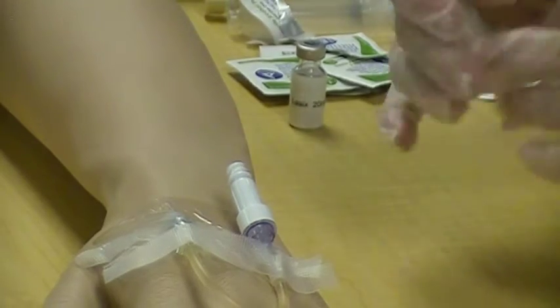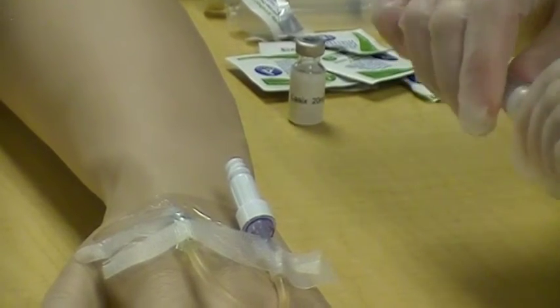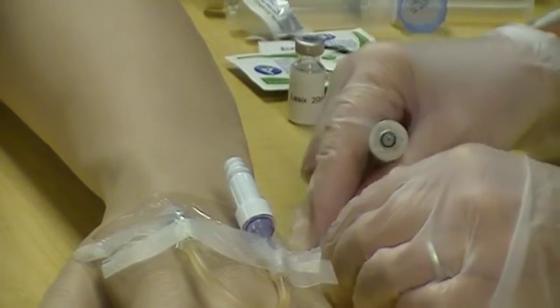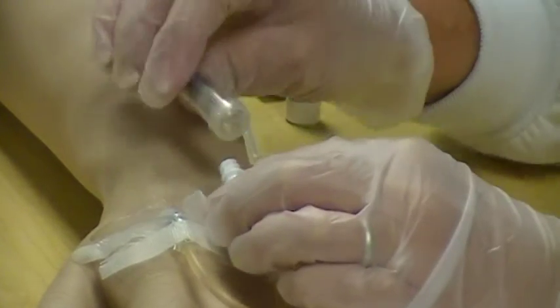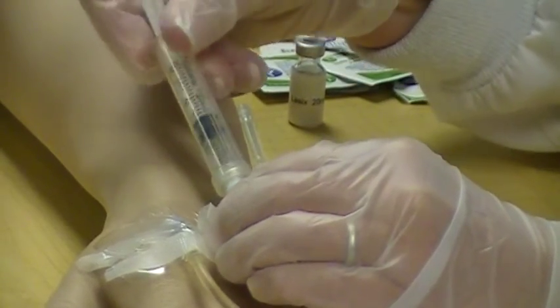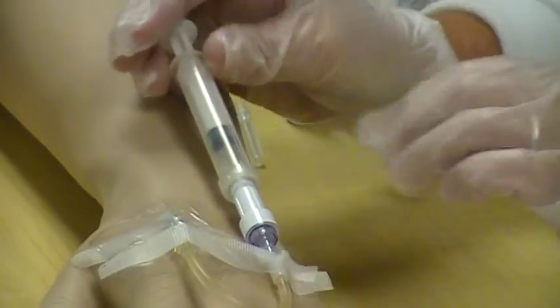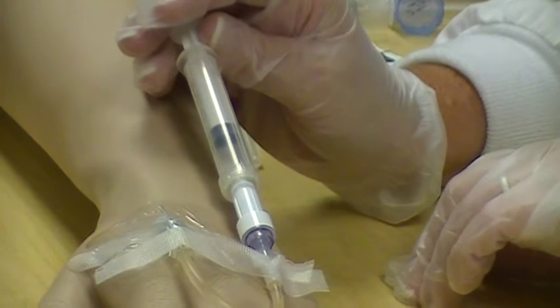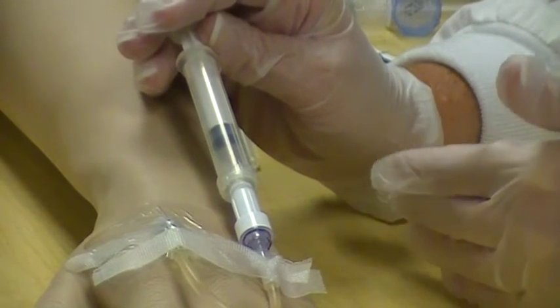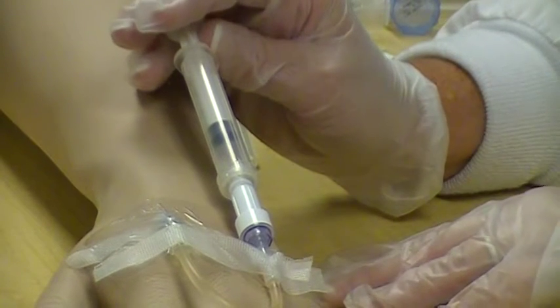Then, because we're dealing with a needleless system, we're going to take the needle off. Place it to the side. Place our syringe on the saline lock. And again, I'm going to time myself giving this medication over either the 30 seconds or the 1 minute. I tend to go for the longer period of time just to make sure that we're safe.